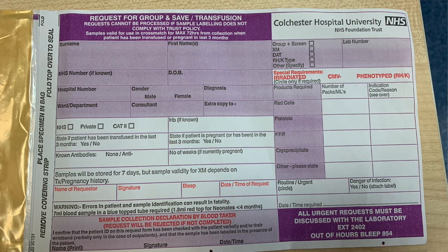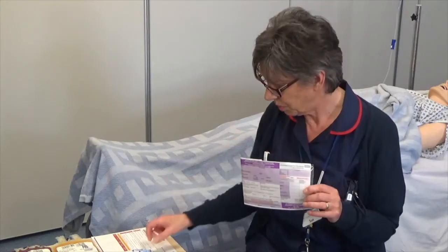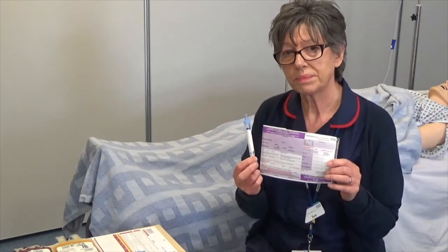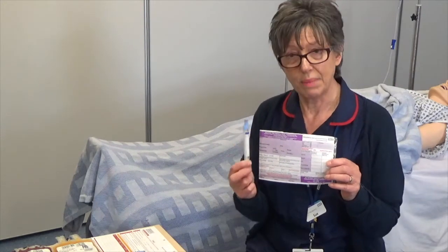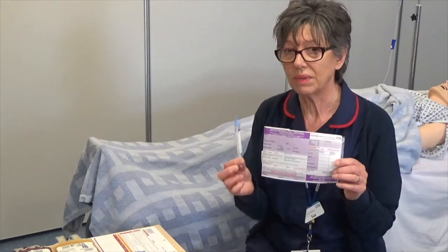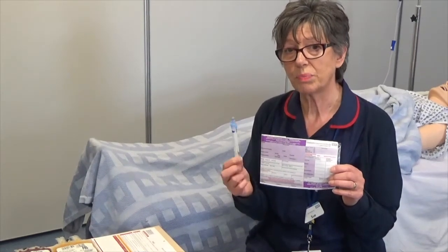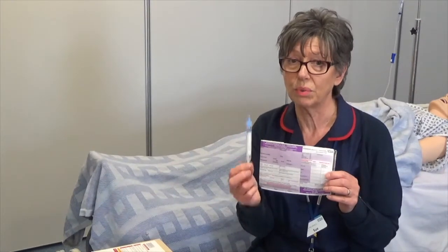So when you do this, you take your form and your bottle to the patient's bedside, identify your patient, take your blood sample, label it all up at the patient's bedside. Please do not leave that patient's bedside until you have labelled it up. If you do, you have the chance of picking up somebody else's details and filling out the wrong details on the bottle.